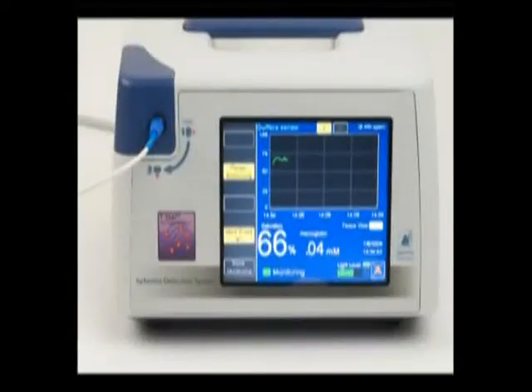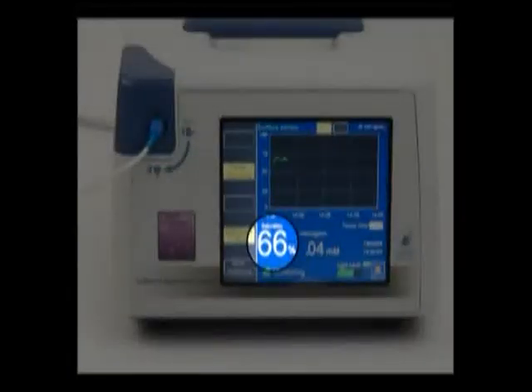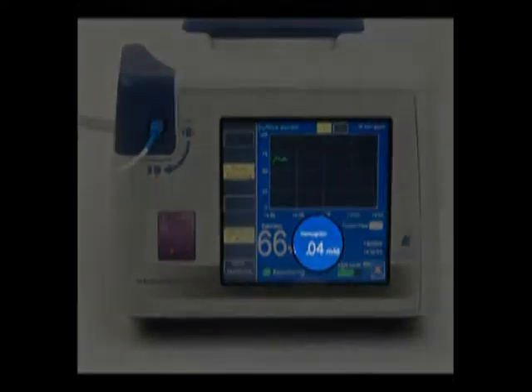Let's review the features of the T-Stat monitor display. The largest number is tissue saturation. In multi-sensor monitors, more than one saturation may appear. The smaller number is tissue hemoglobin content. This is useful in certain procedures, such as free tissue transfers.